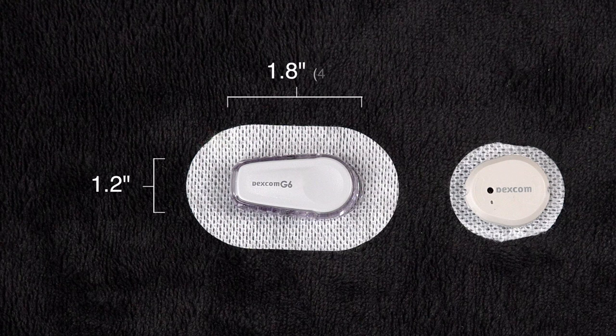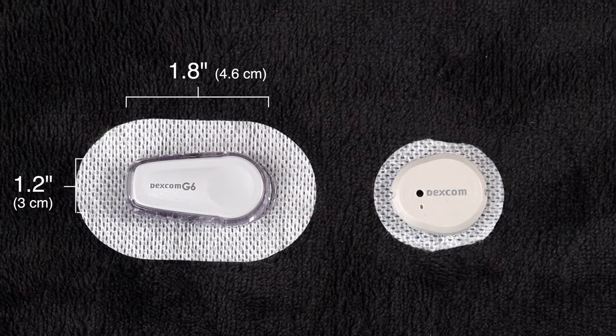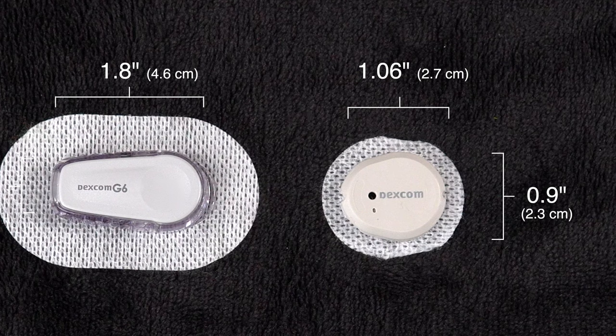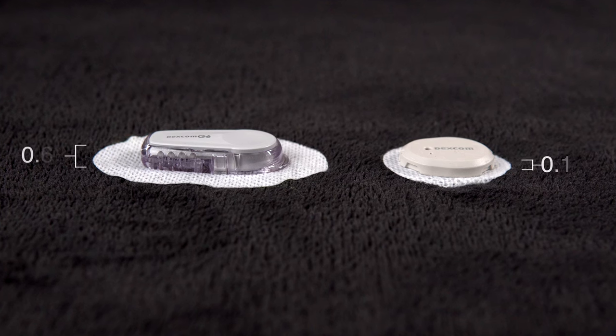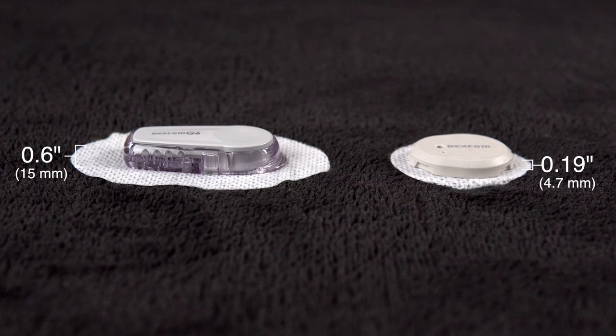The G7 sensor is about 60% smaller than the G6. The G6 sensor is a longer, sort of rounded rectangle shape that's almost two inches long and over an inch wide. The G7 sensor is much smaller, just about one inch by one inch, and not perfectly round, but definitely a more rounded shape. The thickness of the sensor — how tall it stands from your skin — was also reduced by over half, dropping from a little over half an inch on the G6 to less than a quarter of an inch on the G7. That smaller form factor comes with the hope of being less intrusive during day-to-day use and with less likelihood of being bumped off before its 10 days are up. My patients love this change because if you're going to have something stuck to your skin, bigger is not better.